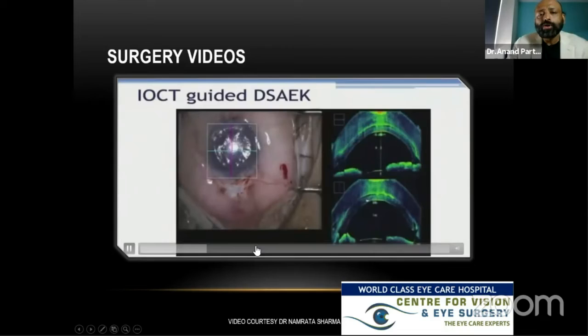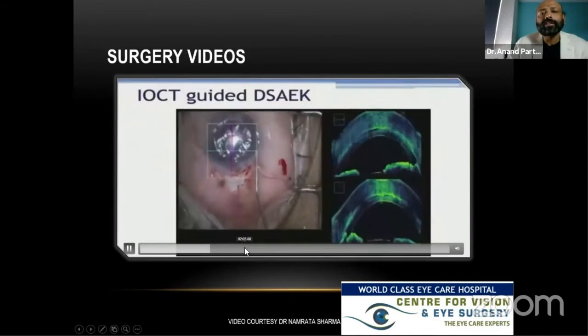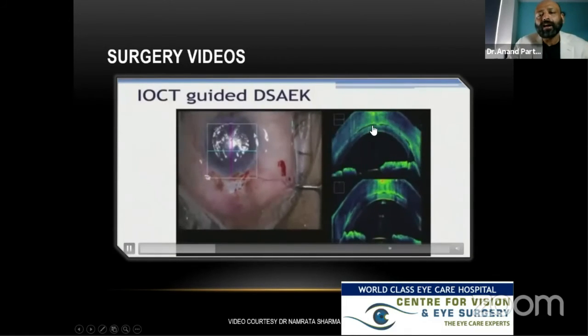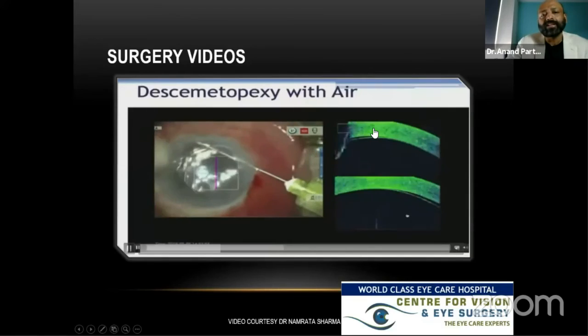So I usually do paracentesis, basically full thickness corneal incisions on the recipient stroma, and you can actually, even when you're injecting air, you can see that the graft actually moves. So you got to make sure that all these water clefts are clear on table. So you might take 5–10 minutes extra.